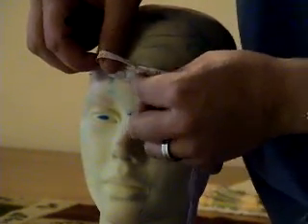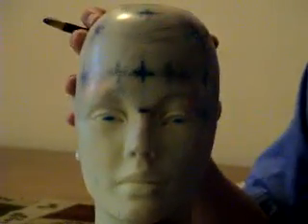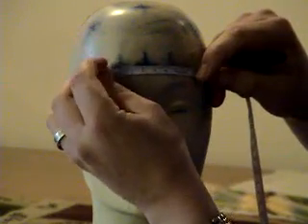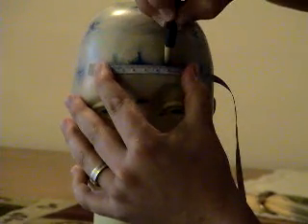That measurement is 46 centimeters. You're then going to take 10% of that, which is 4.6. Half of 4.6 is 2.3. So you want to put that just across the head, just like that. You're going to make a mark right here at 4.6 and a mark right here at 0. Those marks will be known as FP1 and FP2.